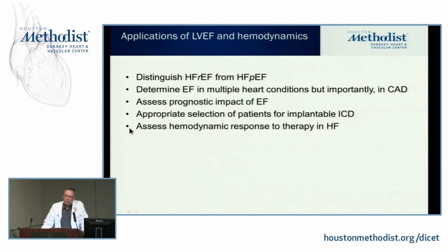Very important. I think when people come back with repeated admissions of heart failure and they get an echo, EF is the least needed information. Because how often do we see a dramatic change in EF from admission 2 to admission 5 in a patient?